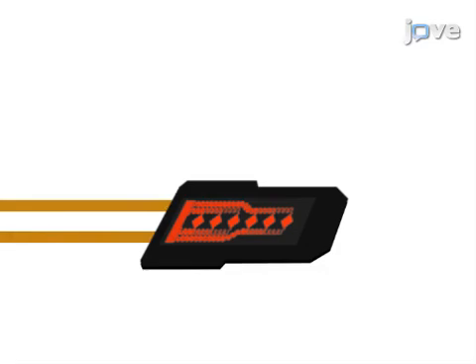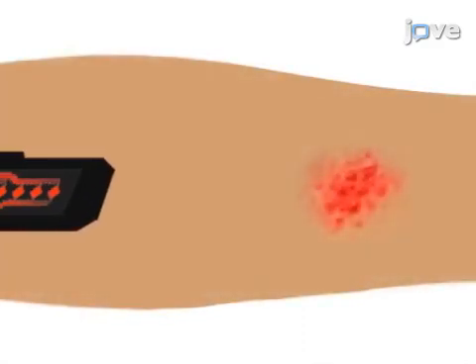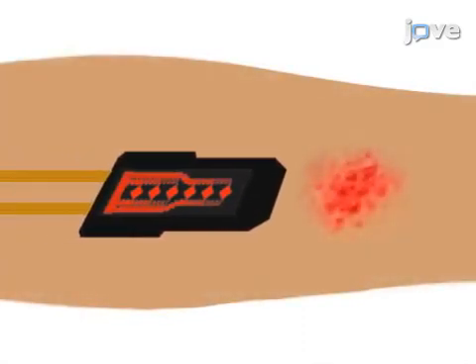Next, the fabricated electronics are retrieved from their fabrication compound and transferred onto the membrane. The final steps are to enclose the electronics with a silicone coating and connect a flexible cable for data acquisition. The completed device is laminated near the wound tissue of a patient to monitor time-varying temperature and tissue thermal conductivity as wound management.